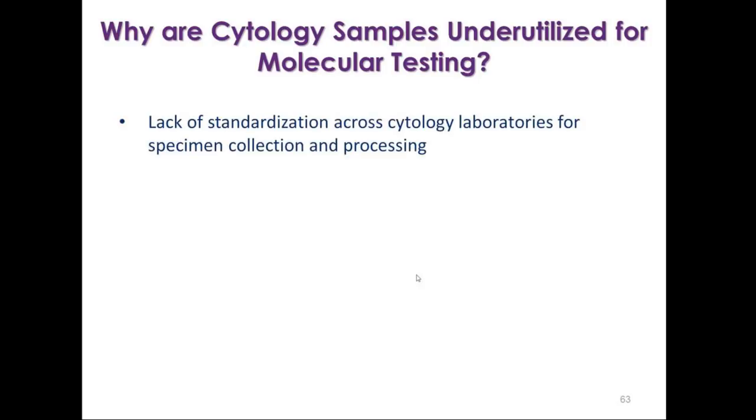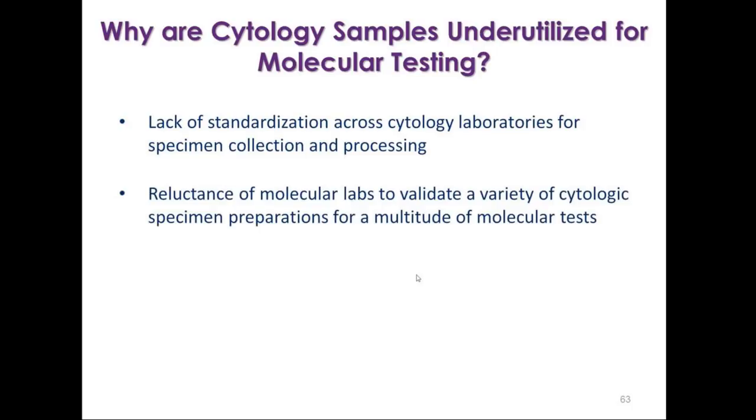The main thing is that there's a lack of standardization in terms of specimen collection and processing. I showed you that different labs use different fixatives and different preservatives, different collection media, different stains. So until we standardize our procedures, it is harder for molecular labs to accept our specimens because for all these pre-analytic variables, they will have to validate the different specimen preparations. So there is a reluctance of the molecular labs to validate these because there's a wide variety of specimen preparations and they would have to validate for a multitude of molecular testing.